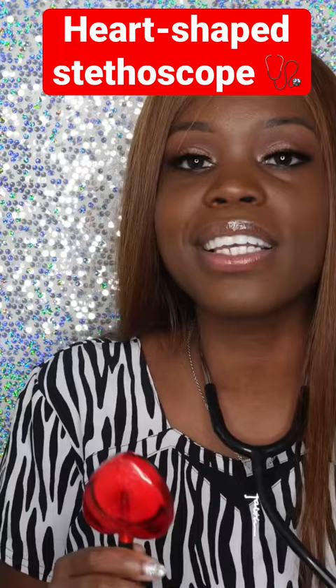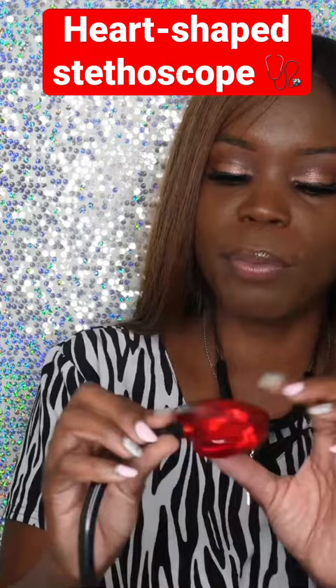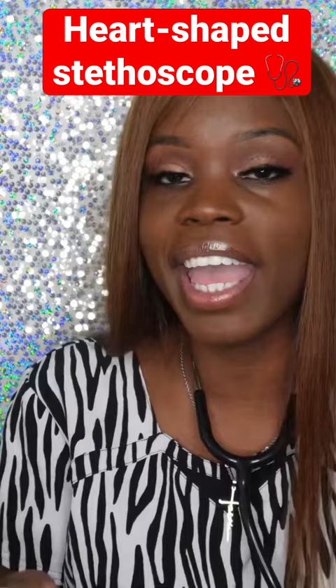They want to touch it. Every time I check my patient's blood pressure, they love it — I get so many compliments on this stethoscope. I've had it for years, so you can probably see it's kind of dinged up right here. If you do get it, just make sure you take better care of it than I have. I have several, but this one is by far my favorite.